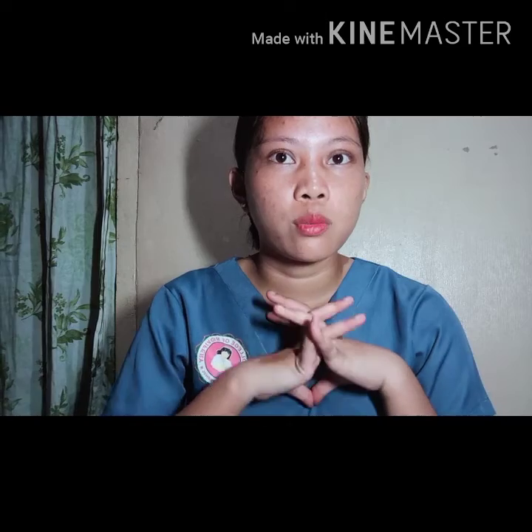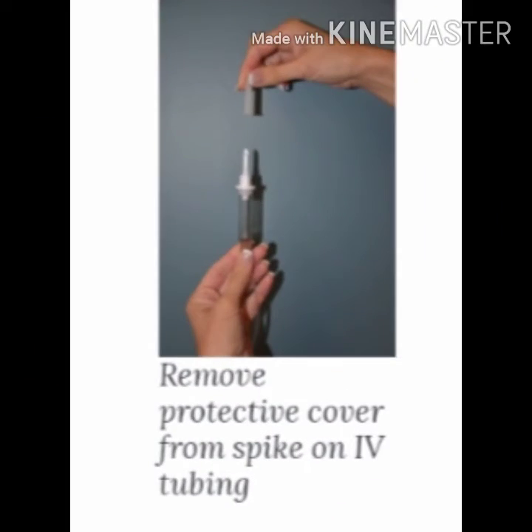Without contaminating the solution port, carefully insert the IV tubing spike into the port, gently pushing and twisting. So without contaminating the solution port, insert the IV tubing spike into the port, gently pushing and twisting.